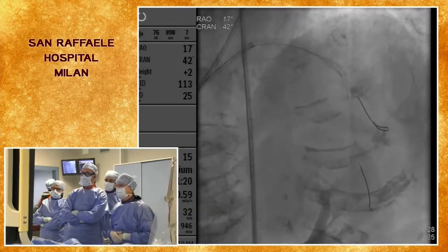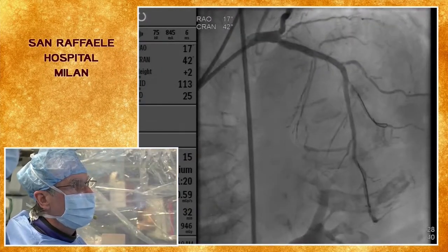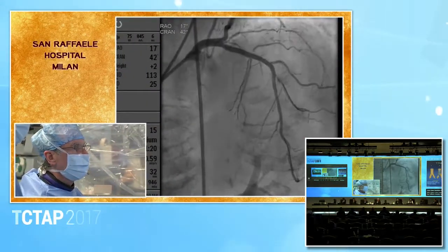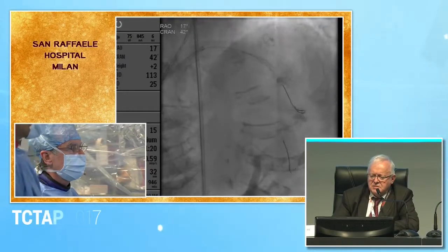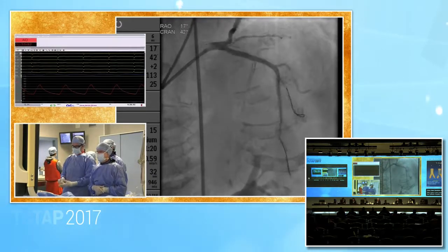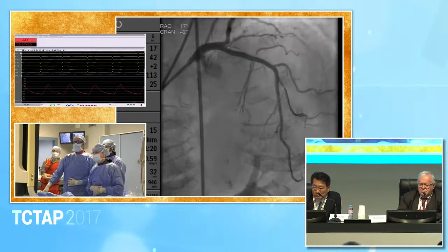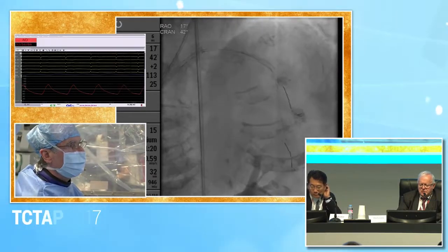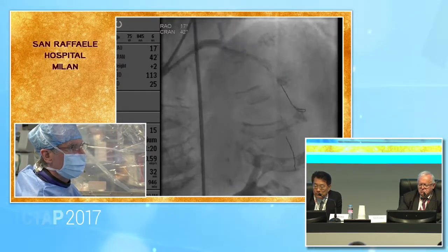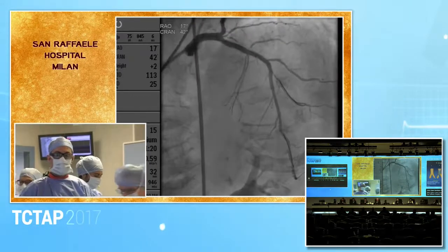Looks okay. The diagonal is a little bit compromised. What do you think, should we wire the diagonal? Are you afraid that when you remove the Grand Slam the diagonal will close? Do you have pain, ST deviation? TIMI 3 flow. No, the patient is asymptomatic and the EKG is fine. She has a left bundle branch block at baseline. What do you think of the second diagonal, the diagonal where you have the Grand Slam? Should we remove the Grand Slam? You can try to go with another wire into the diagonal and open with a balloon, but I don't think this is the kind of vessel you can stent. So, for me, remove the Grand Slam and see. No, but I just don't want to lose it. It may also be a bit of spasm.